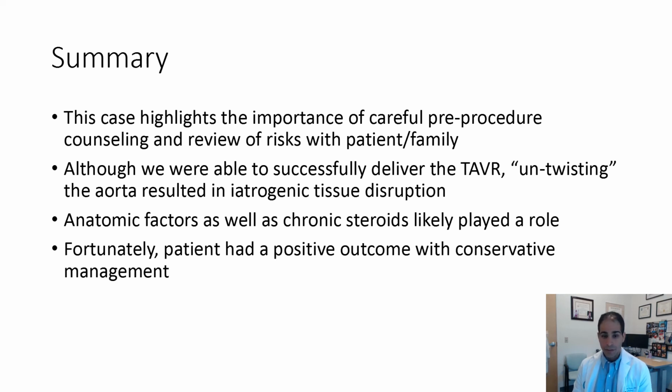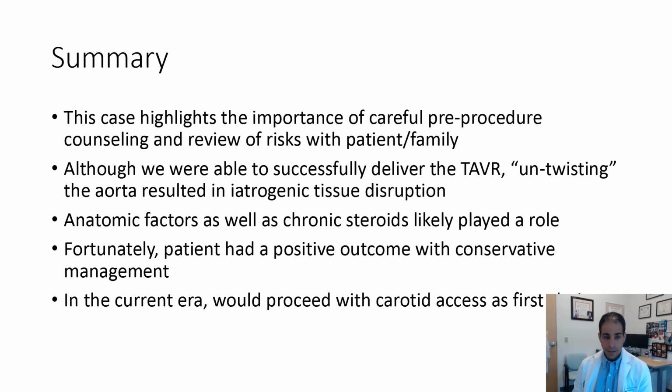We were very, very lucky, and as they say, sometimes it's better to be lucky than good, where we had a positive outcome with a conservative management. In the current era, I would tell you that I would never try this procedure again. Now that we've embraced the carotid access as our alternative strategy of choice, I would absolutely not try to straighten out the aorta again, and I would have embraced carotid access.